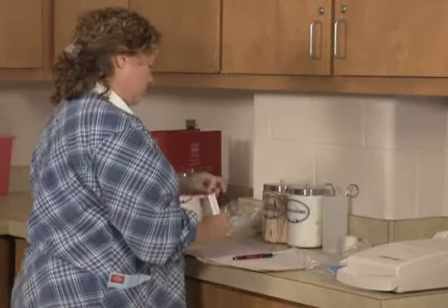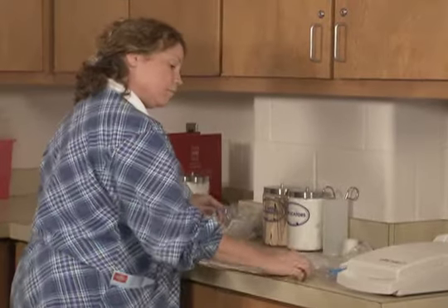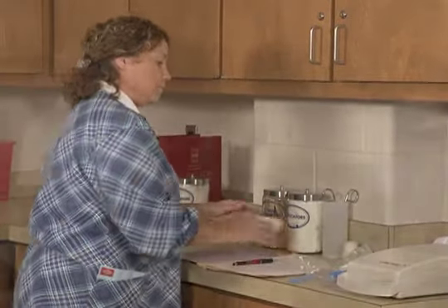To prevent an error, the label should be checked 3 times, as you would when dispensing any other medication. Greet and identify the patient and explain the procedure. I am the doctor's medical assistant, and he wants me to start you on a nebulizer treatment.